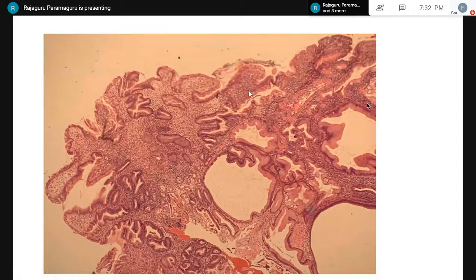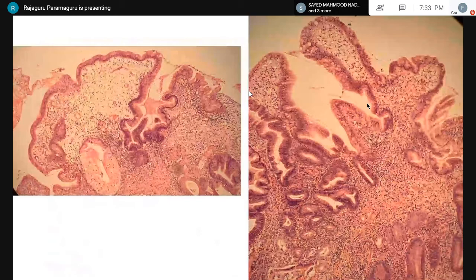These polyps are usually seen in the antrum. As you know, the most common cause of chronic active gastritis is H. pylori, hence these polyps are seen in the antrum. These polyps basically happen due to hyperplastic regenerating mucosa, and in the body they can be seen following autoimmune gastritis. The other areas also show marked edema with hyperplastic foveolar epithelium.